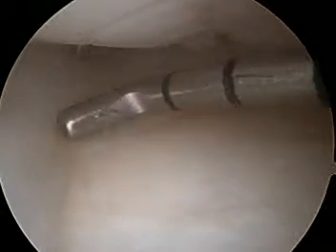We're looking at the interior of the knee joint. We see the thigh bone on the top, the shin bone on the bottom, and the inner or the medial meniscus cartilage back here. And you can see that inner cartilage looks fine. However, on the end of the thigh bone, there's certainly some roughness here. You see some jagged flaps in this area.